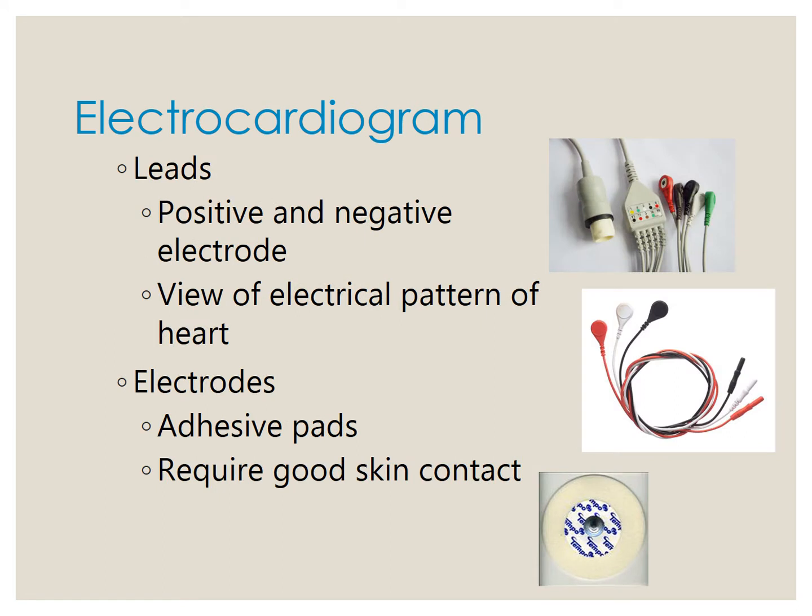Moving on here, the monitoring system typically has a 3-lead or a 5-lead system. We even have 7 leads, then we have our whole 12-lead EKG. But just for you today, we have a 3-lead system here, and they are color-coded cables. This is a universal color code. If you commit this to memory, then if you see any 3-lead ECGs, you can know where they're supposed to go on your patient. The negative lead is usually white, the positive lead is red, and the ground lead is black, green, or brown.